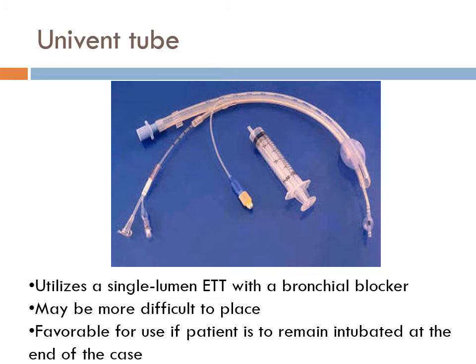When you go to open your tube to check the cuffs, make sure that little adapter that goes in here is always on tight. It just popped off, but whatever. You would notice it when you go to hook up. I got a normal tube in. Bring them to the ICU.